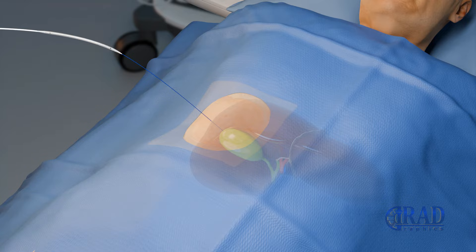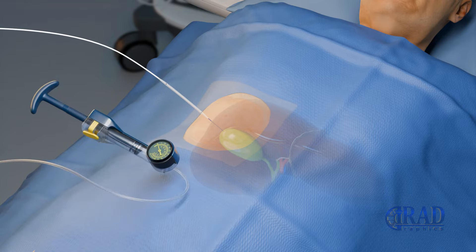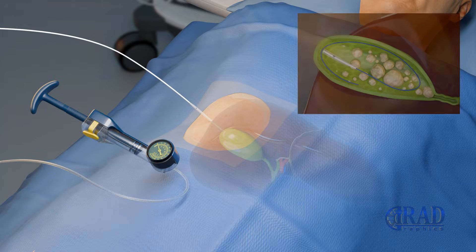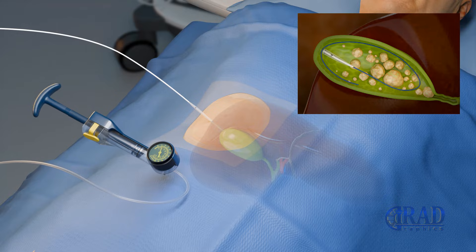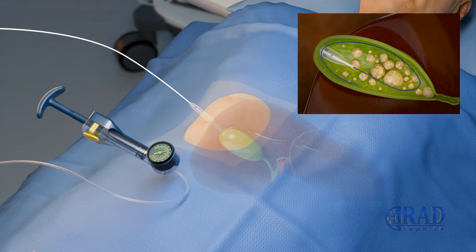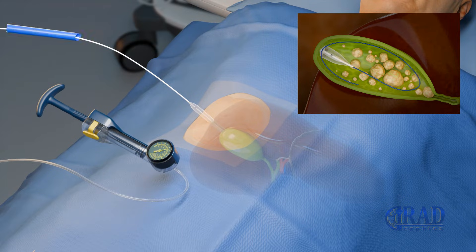At this point, a Nephromax catheter mounted on a balloon is advanced over the guide wire. The balloon is inflated to dilate the access track, creating a pathway for further instruments.